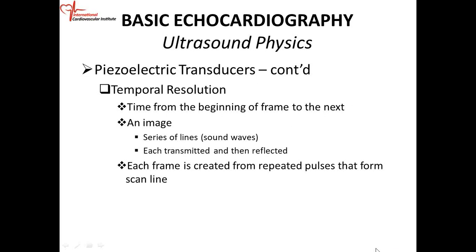So when we talk about temporal resolution, it's the time from the beginning of one frame to the next frame. Okay? It is the time from the beginning of one frame to the next frame. So it's the frame rate.